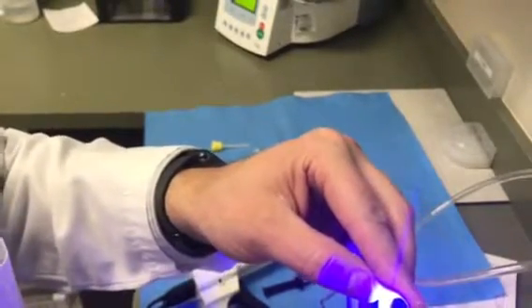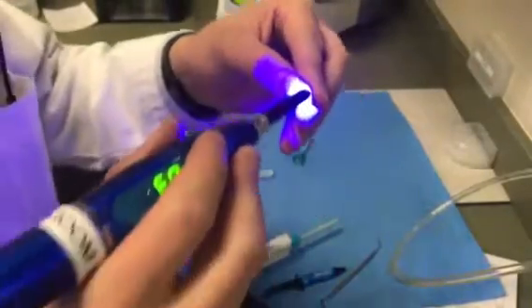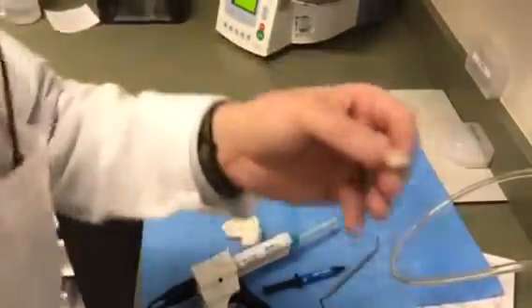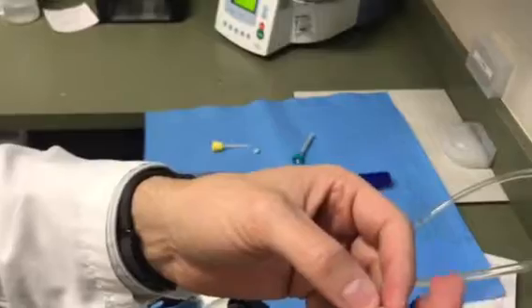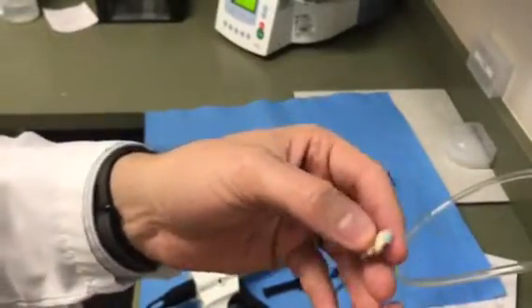I want them to do a prettier job than I do with it, and I tell them that specifically on the lab slip. Like, basically, do what I did, but make it prettier. But then the lab can do an overlay, kind of mold over this, and build the porcelain out essentially just like you have it, giving them a clear model of that.